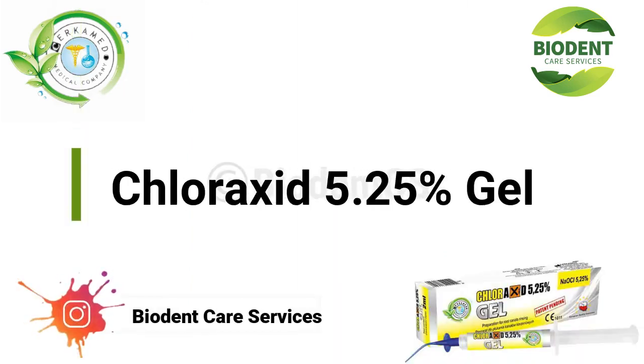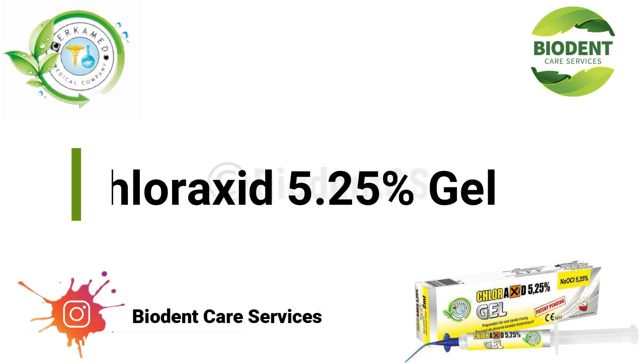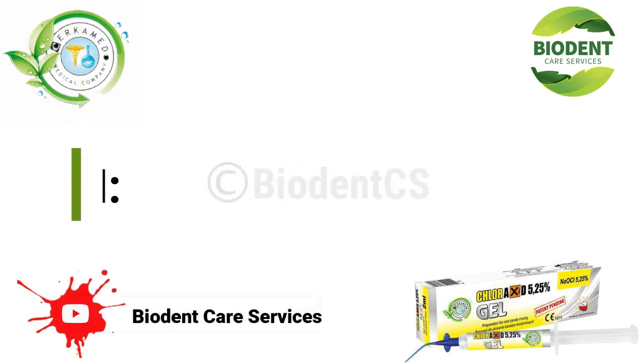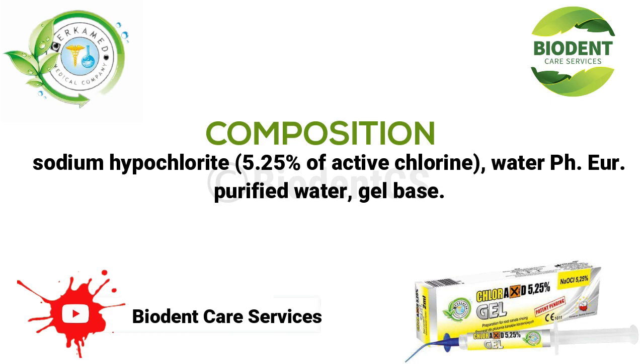Chloroxid 5.25% Gel. Composition: sodium hypochlorite, 5.25% of active chlorine, purified water, and gel base.